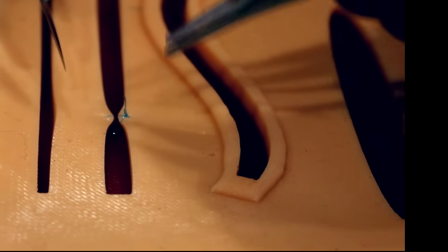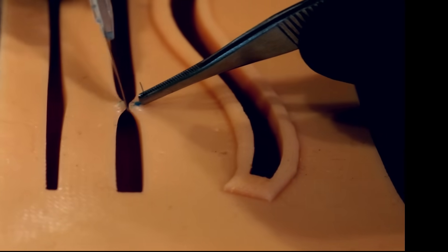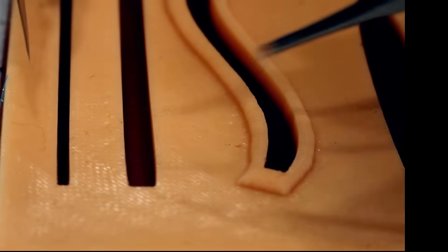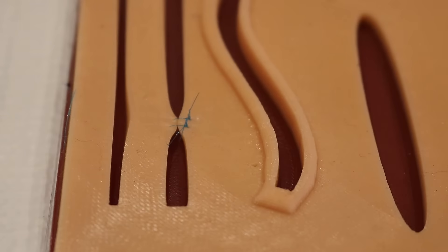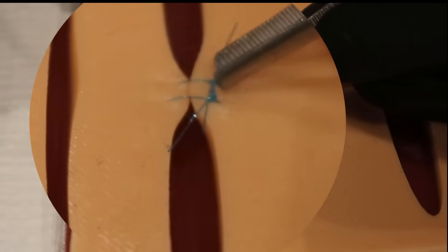I'm going to grab the tail, lift the suture just a little bit, and nick it right there in the middle. Usually it comes right out very easily with this number 11 blade. Very sharp, sometimes found in suture kits.